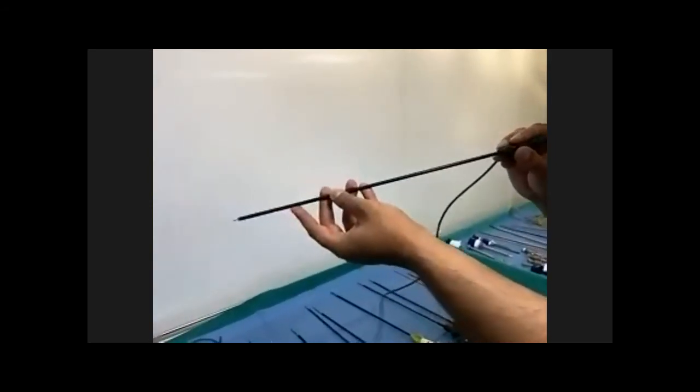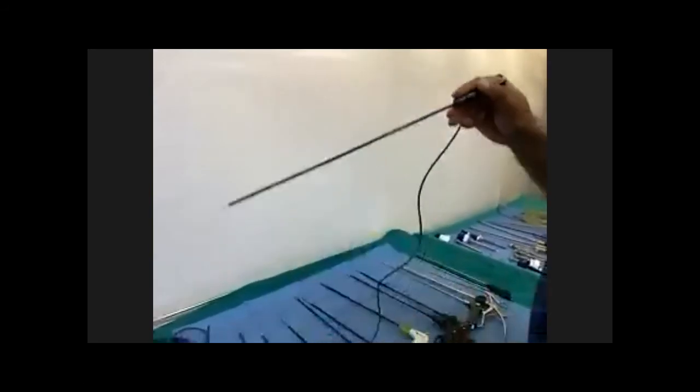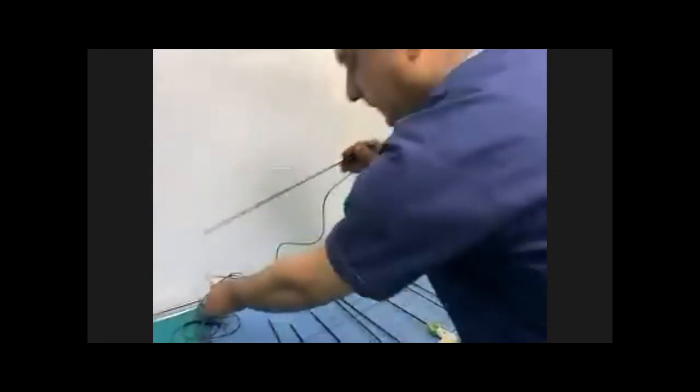You must have used this in the laparoscopic cholecystectomy, and it can be used in almost all the laparoscopic surgeries.